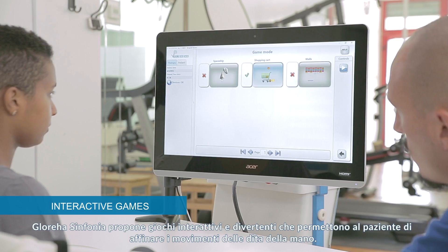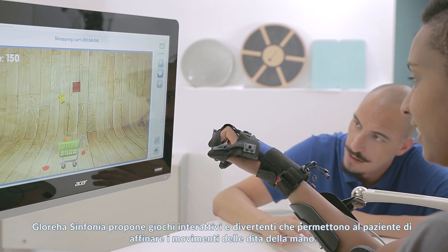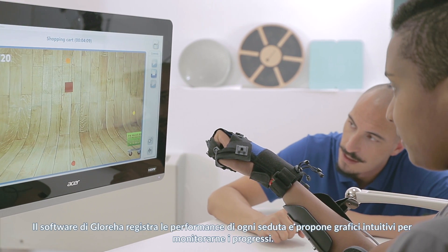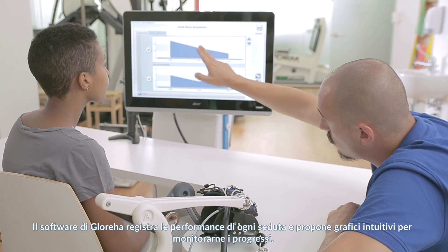Interactive and fun games are available within Glorea Sinfonia software, where fingers can be trained to sharpen movements. Glorea software records every performance of each therapy session, showing intuitive charts to check improvements.